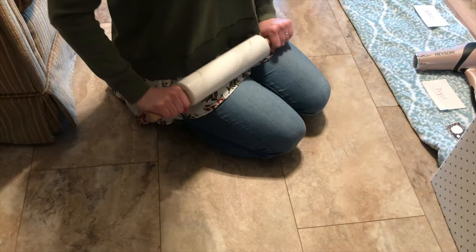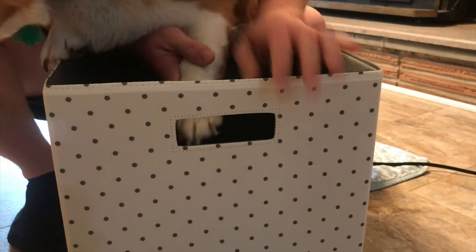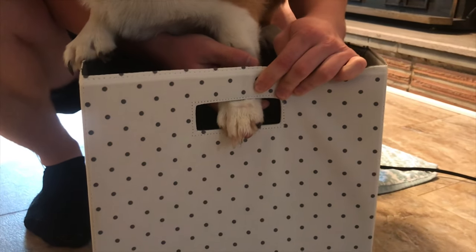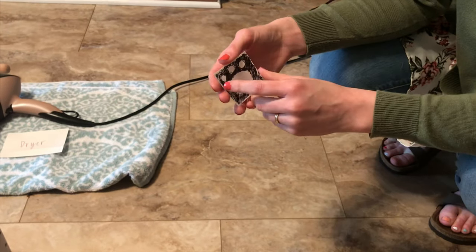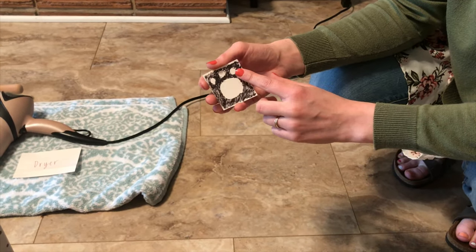After it's dried, it's going to roll to the film recovery slot. The film will come through the film recovery slot — this is the result film, which is Benji's paw. The part that is white came from the fixer, and the part that is black came from the developer.